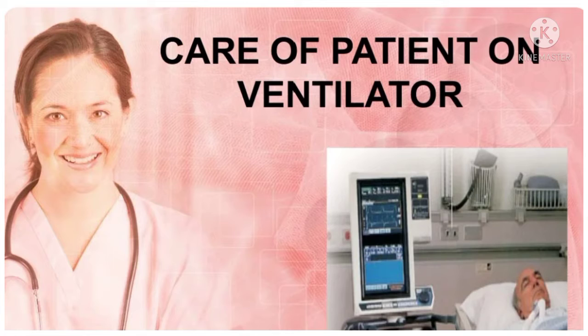Nursing care of the patient on ventilators. Observe the physical signs such as color, secretions, breathing pattern, and state of consciousness. Observe the tidal volume and pressure manometer regularly. Intervene when they are abnormal, for example, suction. If airway pressure increases, the nurse should continually assess the patient for adequate gas exchange, signs and symptoms of hypoxia, and response to the treatment.